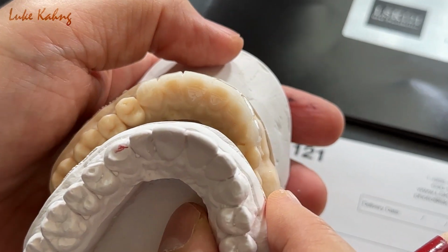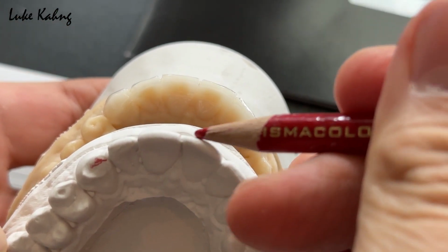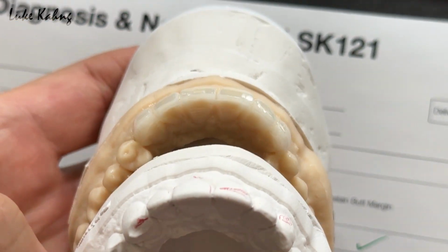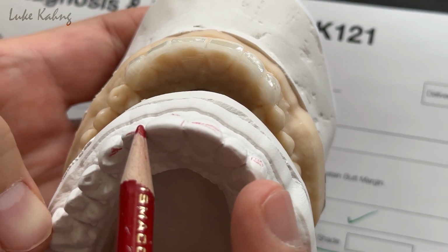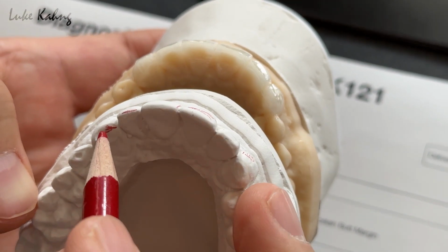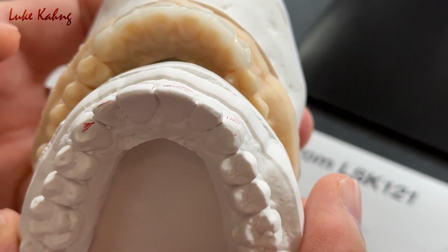So this is the occlusion view. And here this is convex, so I'm trying to make it a little flat. And then also that one is a tuck in, tuck out, in and out. So we're trying to make good alignment together.